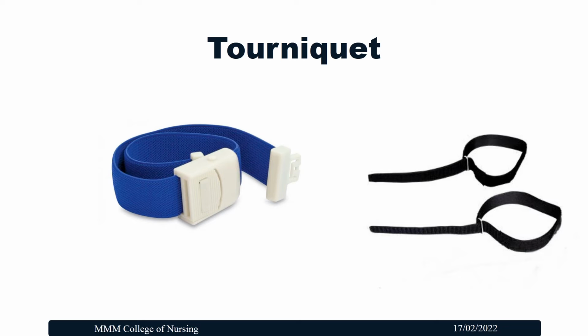A tourniquet is a device with velcro material or a plastic lock type, which is commonly used over the extremities to occlude the blood vessels, that is to stop or limit the blood flow, which facilitates the procedure of IV cannulation.